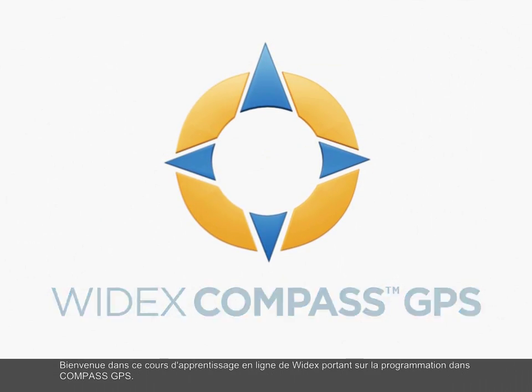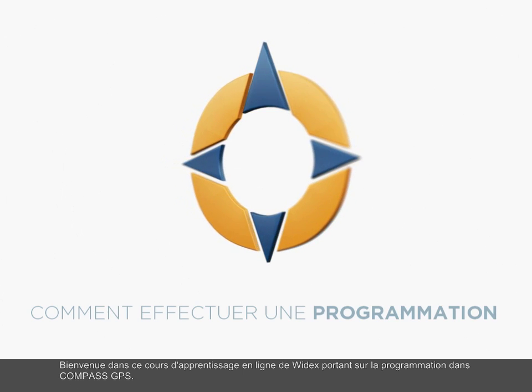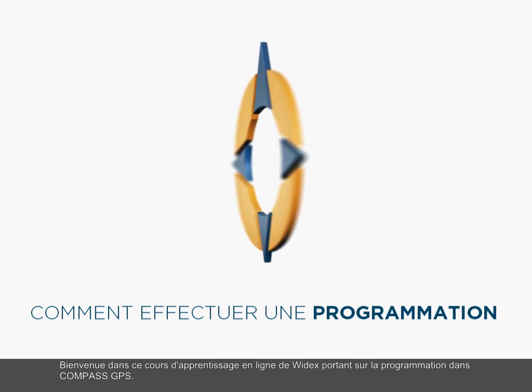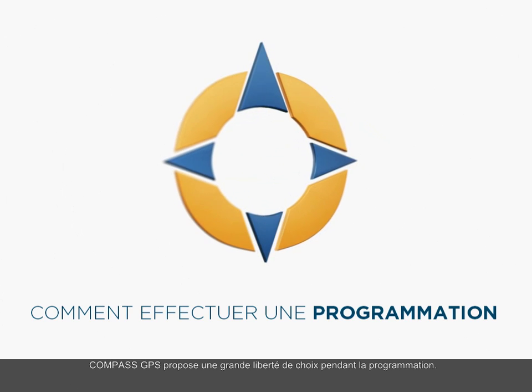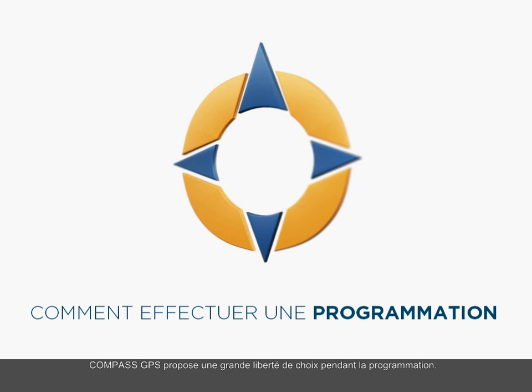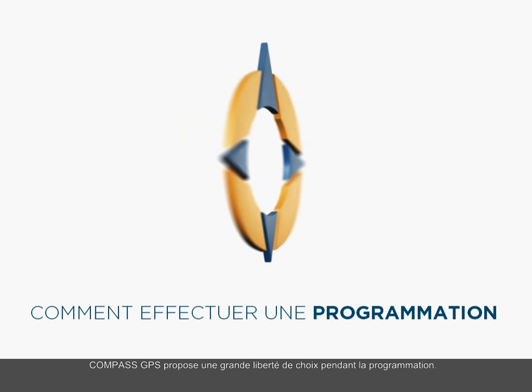Welcome to this e-learning tutorial on fitting in Compass GPS. Here you can see how Compass GPS offers freedom of choice in the fitting process.